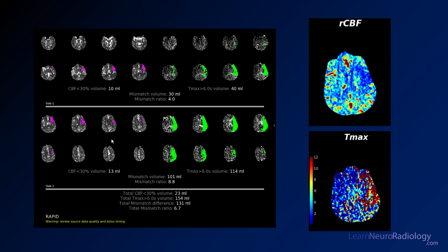We see on the RAPID automatic perfusion that it looks like there's an area of decreased cerebral blood flow in that area that we were concerned about on the CT, in the left inferior frontal lobe and the insula. That kind of makes sense, particularly given the symptoms of right-sided weakness.